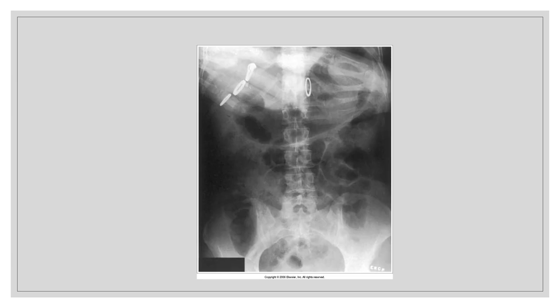What type of artifact is present? There is an external artifact, the ring, and there is an anatomical artifact, which are the hands.